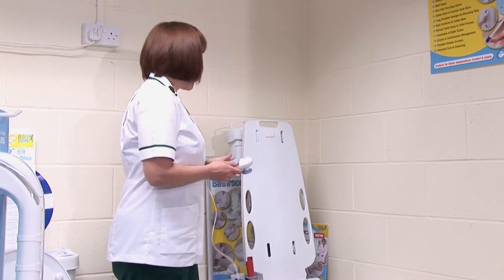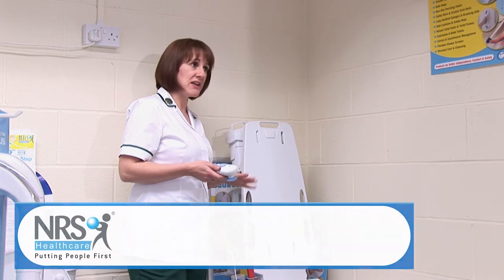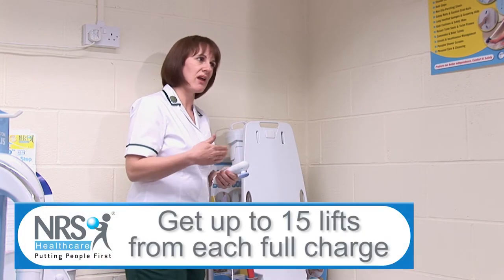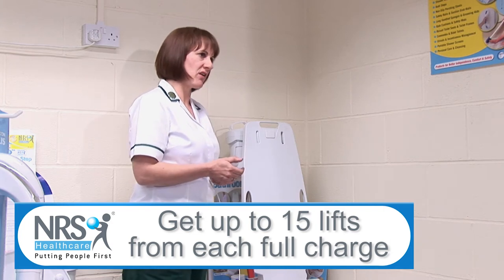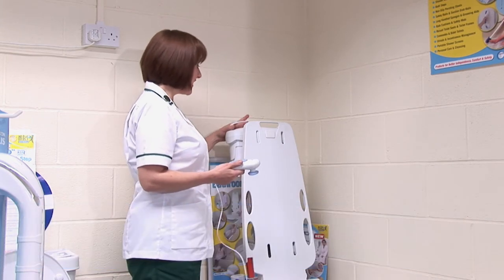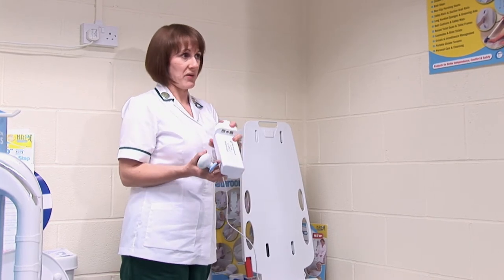What's the shelf life of this battery? How many occasions can you go up and down with the lift? It will give you an average of about 15 times that you can go up and down, but it will depend on how heavy you are. Generally speaking, an average of about 15 times you can lower. And then when you need to recharge it, you just plug it into a separate socket outside of the bathroom.